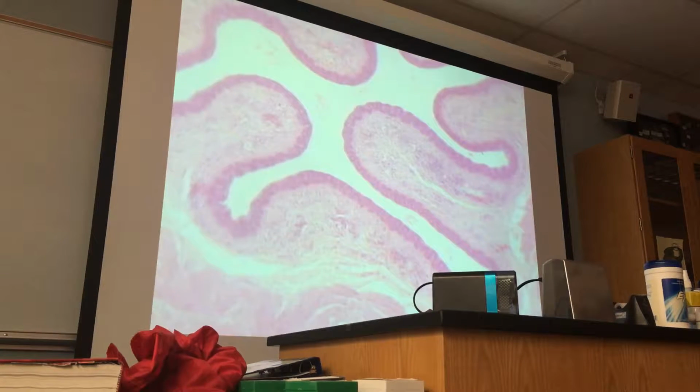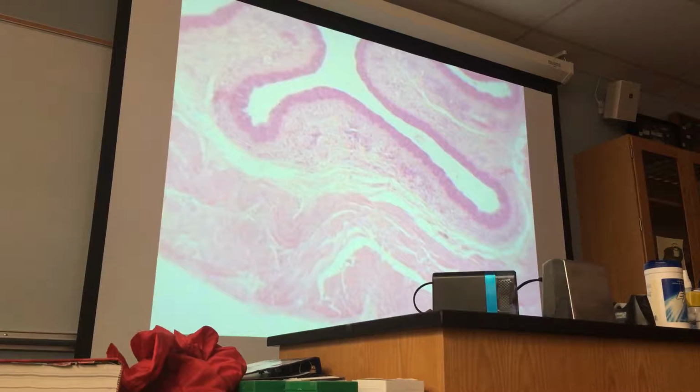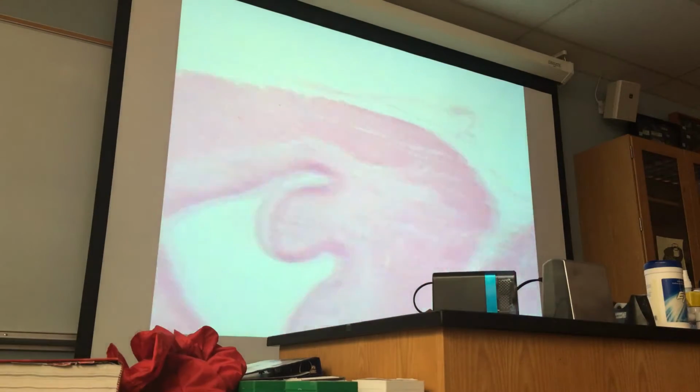And here, this is a part of the mucosa, the lamina propria. You can see the submucosa, and here is muscularis, inner circular layer, outer longitudinal layer, and this is adventitia. There is no epithelium, so serosa is absent. Serosa is composed of epithelium and areolar connective tissue, but here only areolar connective tissue forms the adventitia. Okay? You can go all around.